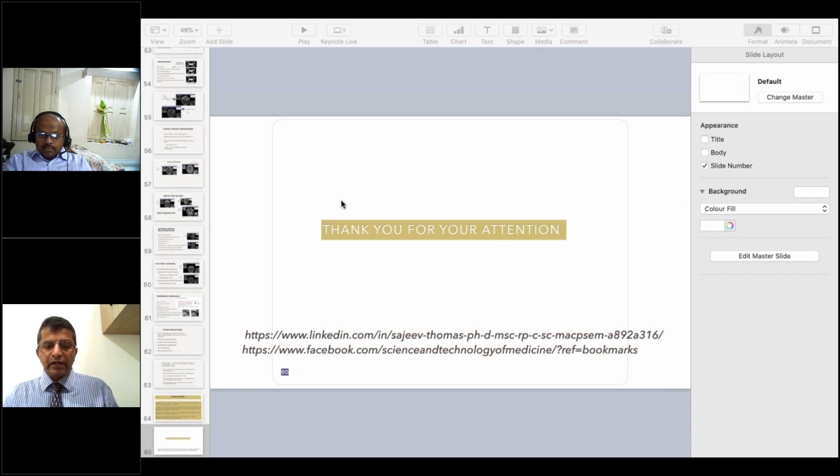What is the recommended conformity index for tolerances? Ideally speaking, there are no tolerances that we have defined. It is from center to center, and there are different conformity indexes which give you values in different ways. But in most cases, we try to keep the variations within 1 to 2%, not more than that.